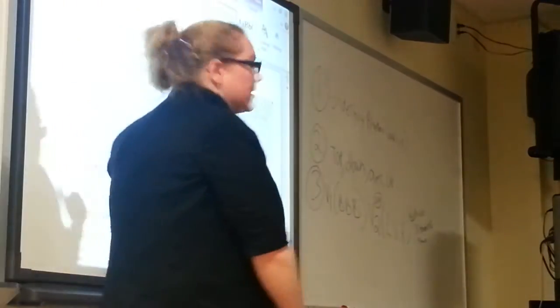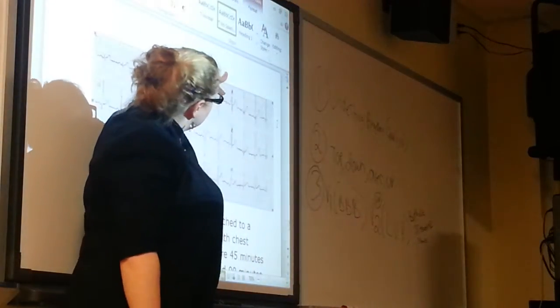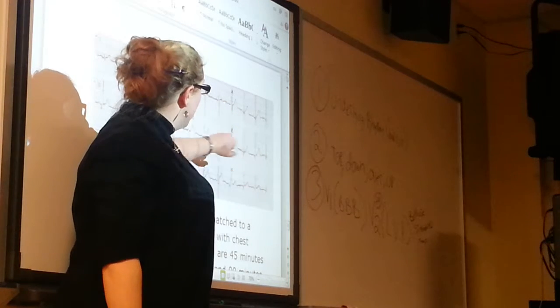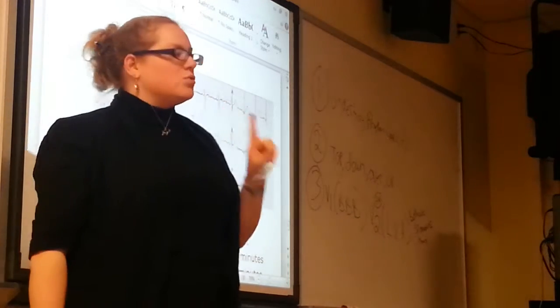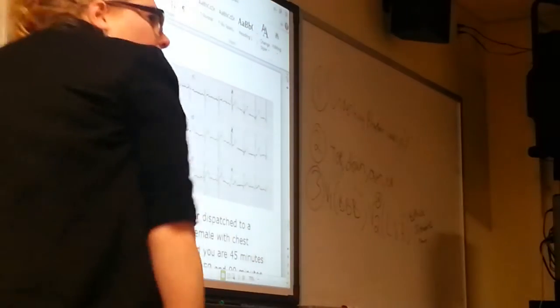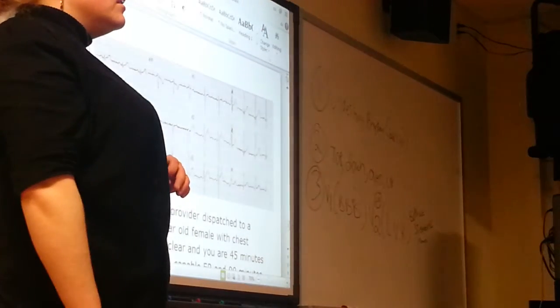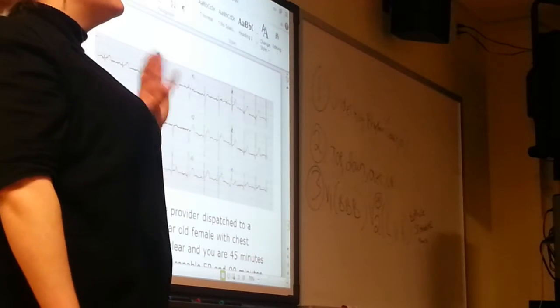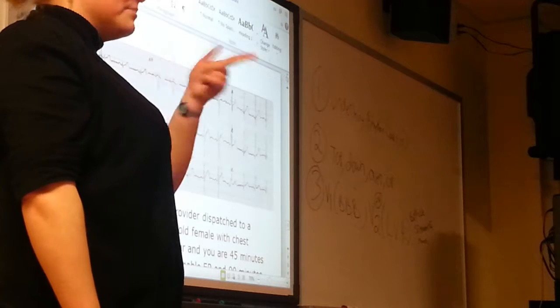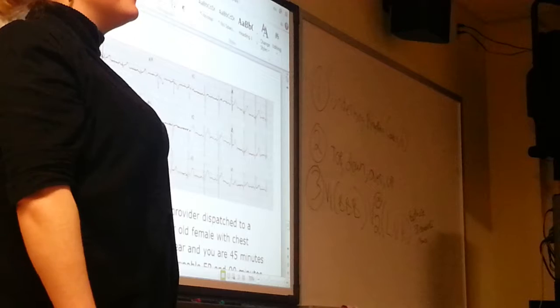Yes, starting at the isoelectric line, here down, here to here, plus here to here, needs to be 25 little boxes or more. Because not everyone is going to have that tail coming off of it. 25 little boxes, 5 big boxes. That's a lot of boxes.